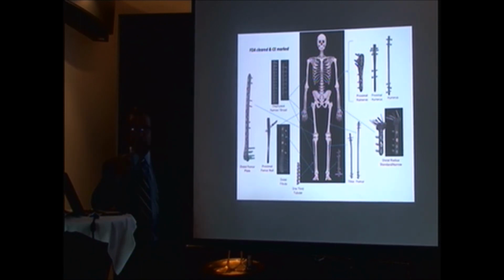But for intramedullary nailing, for the tibia, the humerus, the femur, the hip, and the periarticular fractures where you want that shape, the technology works very, very well.